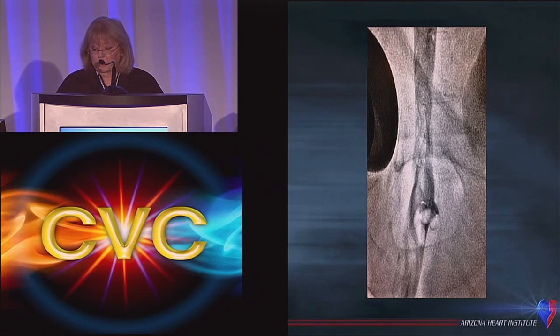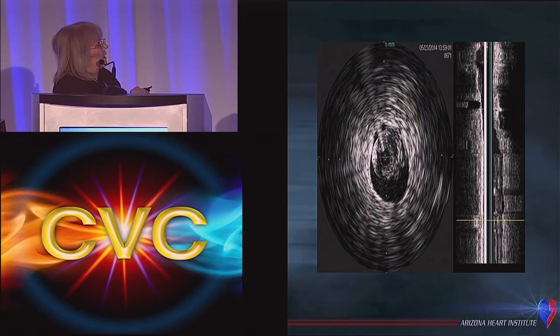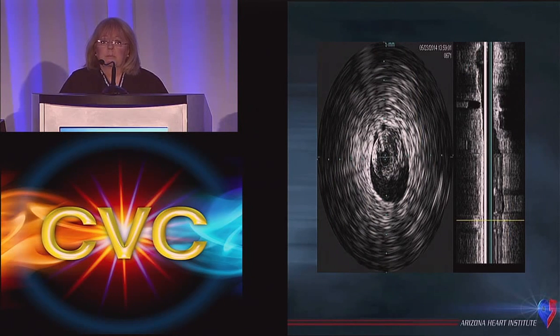And so I wanted to show you that the IVUS is very interesting. There's a big piece of thrombus sitting right here in that vein. It's partially occluding flow. He was symptomatic, and he had an iliac condition that he didn't even know about, actually. But I couldn't move it, and the IVUS didn't change. What we did was we put him on lytic therapy over the weekend. It happened to be Memorial Day, so he got stuck in the ICU for a few extra hours, and the clot completely went away.